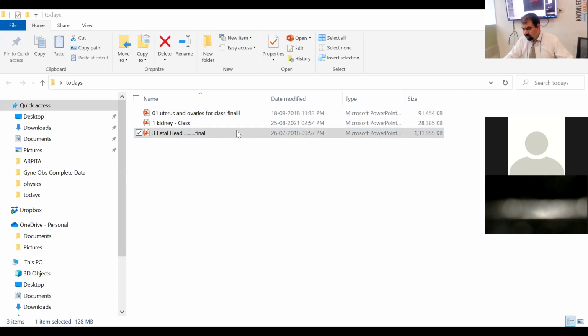First of all, I have to identify the corpus callosum, and how to identify it. Probably you are now clear with the sections. That is the mid-sagittal section, a complete mid-sagittal section for the corpus callosum. Yes, I got it. So in our image, what we are seeing, first, make a habit of getting the splenium, body, genu, and rostrum. So get all these things. Probably it is not sharing. I am sharing this.